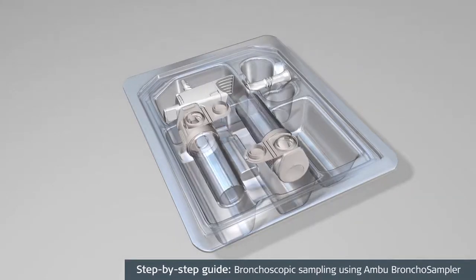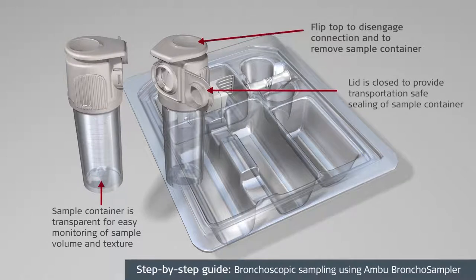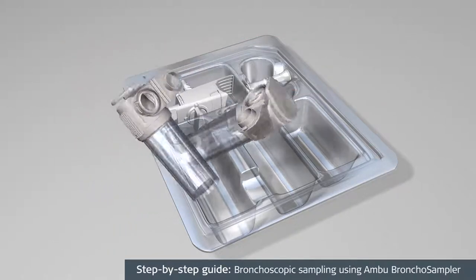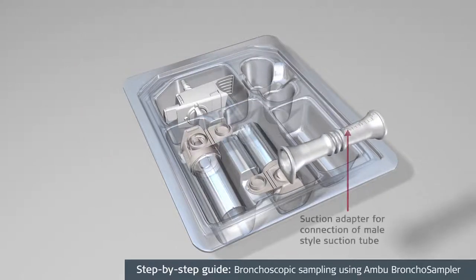The sample container is specifically designed to attach to the sampler bridge via the connection interface and flip top. The suction adapter allows the user to connect the tubing with a male end.